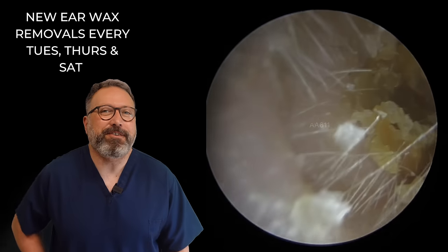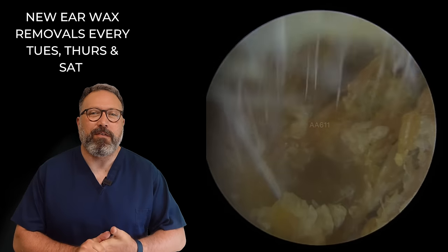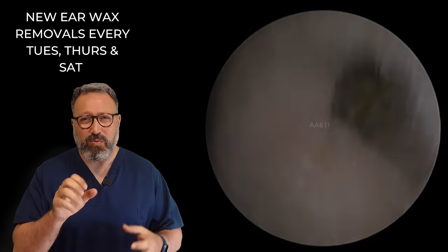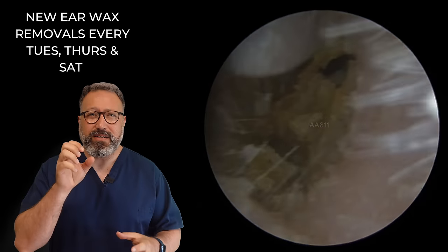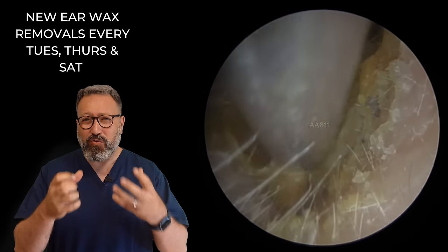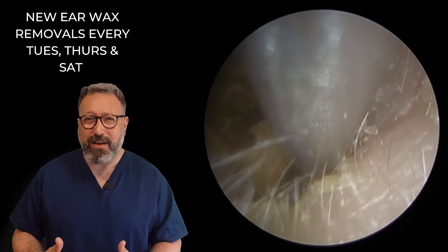Hi everybody, this is Rhys Barber from Audiology Associates. Thanks very much for watching this earwax removal video today. We've got one patient in this video, and this patient's earwax was really, really tough. What you can see is it's very dry, very crumbly, and there's a lot of dry skin mixed in with it as well.